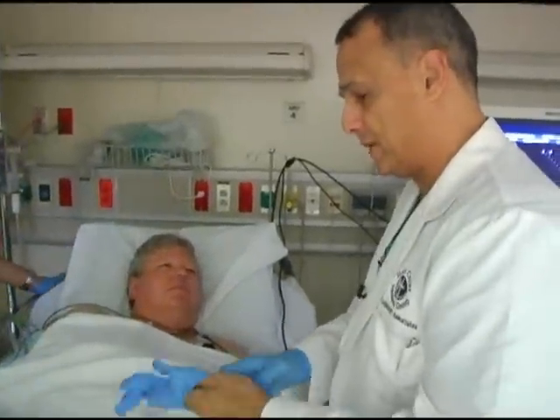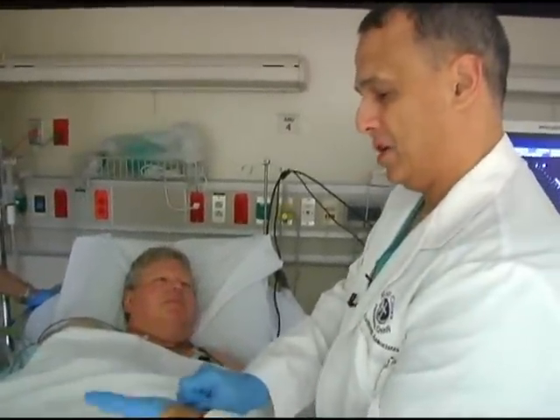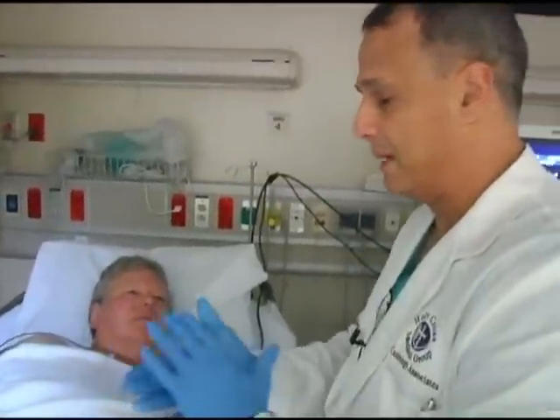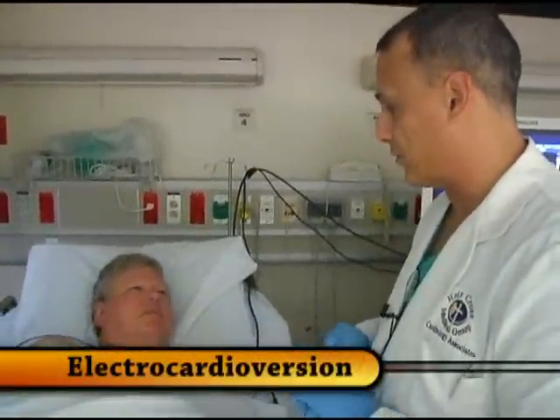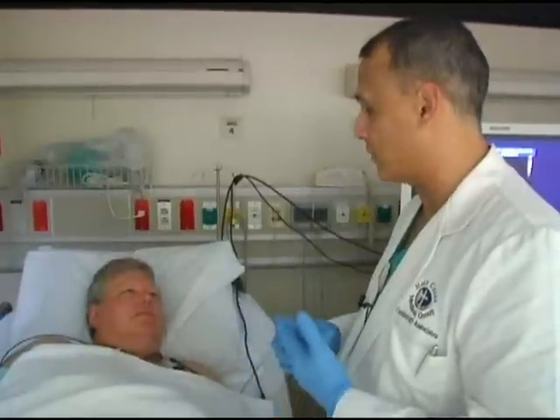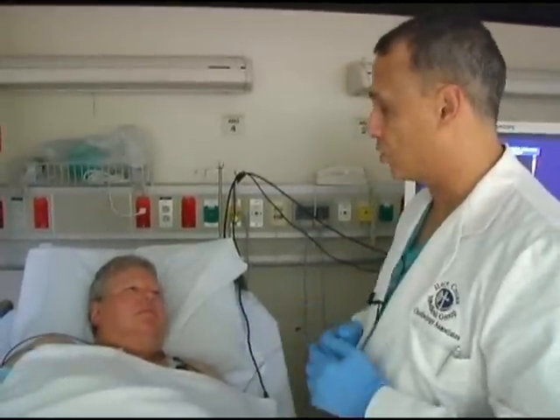What we're doing today is trying to see if there's any blood clots in your heart so that we can then proceed with an electrical cardioversion and jumpstart your heart back from a rhythm disorder called atrial fibrillation back to normal rhythm.